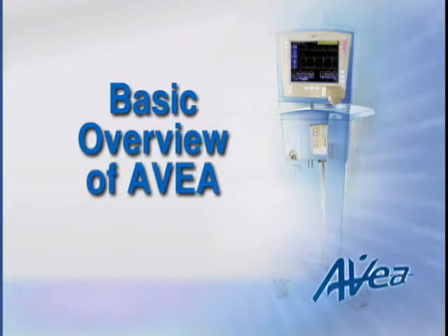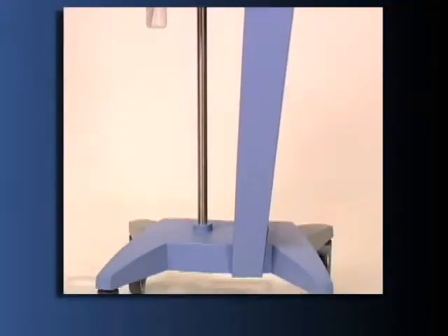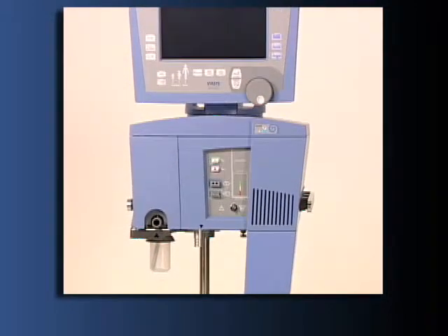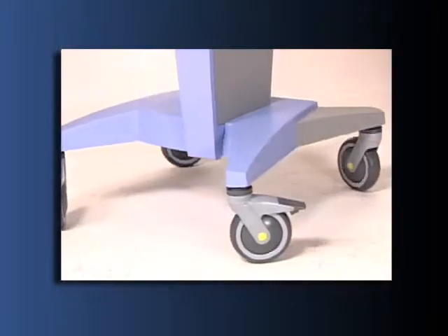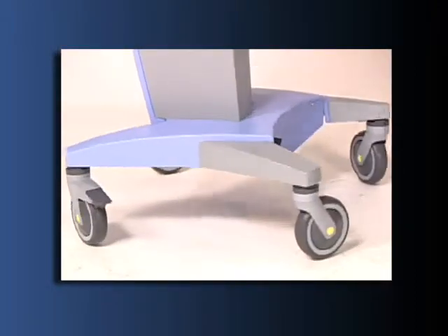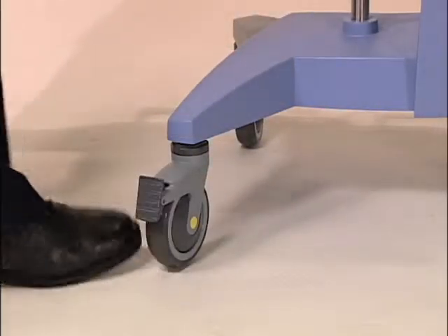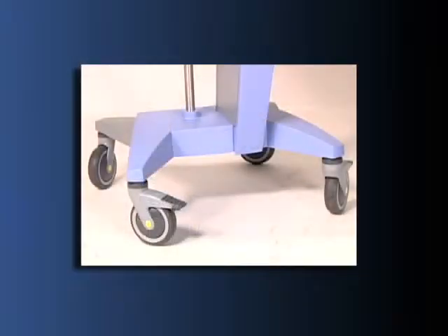AVEA is constructed in three distinct modules: the cart, the ventilator body, and the user interface module, or UIM. The comprehensive cart is constructed for ease of intra-hospital transport as well as improved functionality. The large casters can be locked to prevent forward and backward as well as lateral movement. The optional external battery is conveniently housed in a compartment located in the base of the cart. When installed, this feature extends AVEA's battery operation from two to eight hours.